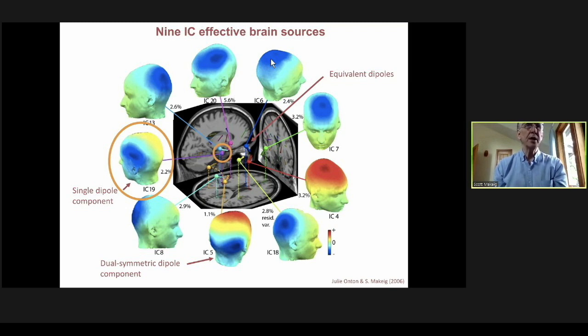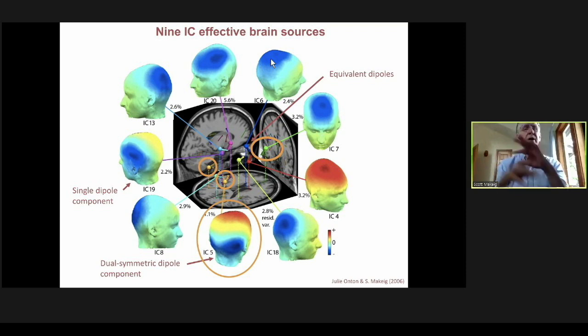And it's quite amazing how closely these maps can resemble the projection of a single cortical patch. Or here, two bilateral, bisymmetric patches that could be easily coupled by the corpus callosum. And you can look at many of them at the same time, and you can look at their interconnections and their relationship to experience and to behavior.